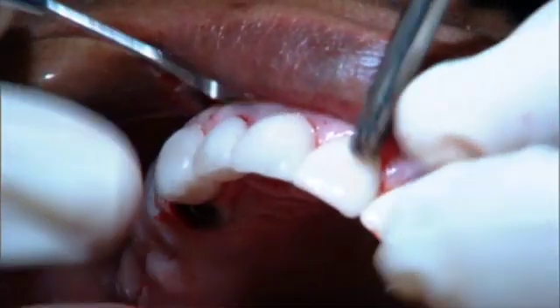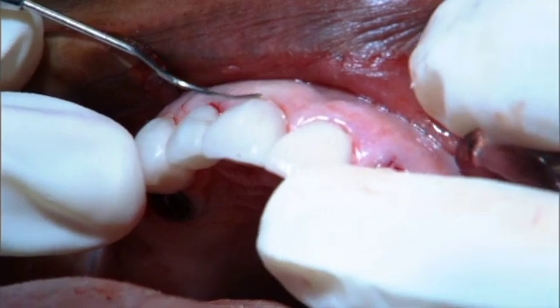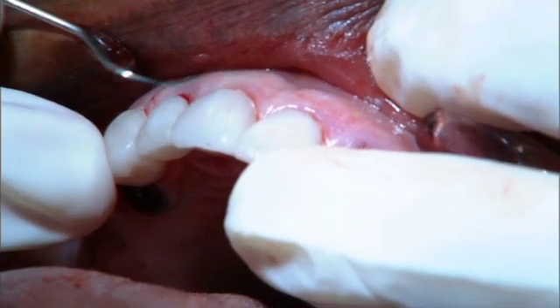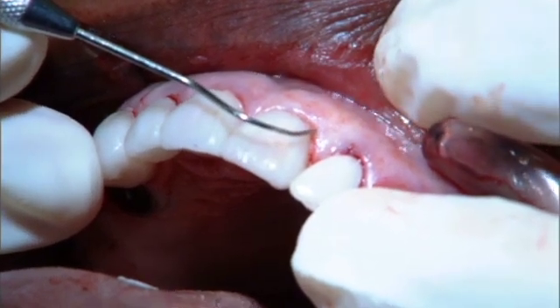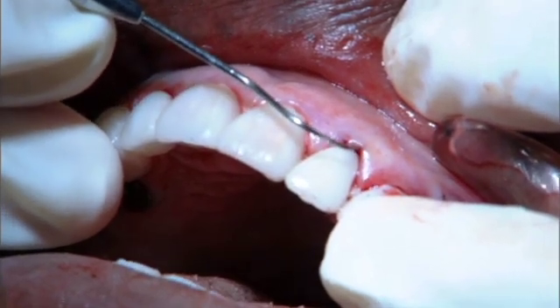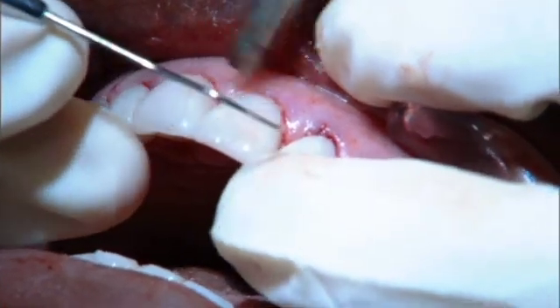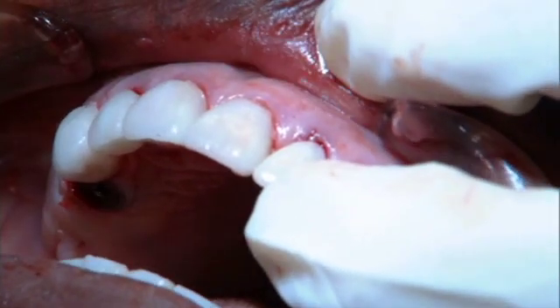The other side too. We learned from Walter Gephardt about zeniths, and so the zenith of my prep on a central is going to be right where my Explorer is. And so my prep needs to go up higher here so that this line angle can go right up under the tissue. The same thing here. The line angle of this number 9 needs to go right up under, and the zenith of my prep needs to be right there so that they will intersect up there. In terms of a lateral, the zenith is dead center, right in the middle, just like a canine. So we want that line angle to go right up under the tissue, support that soft tissue. I now have the luxury of being able to add to this anytime I want to generate the interdental papilla just the way we like.